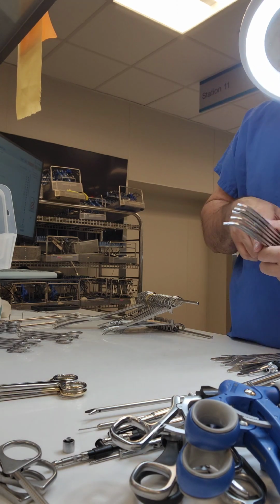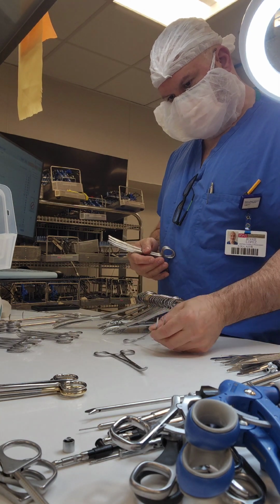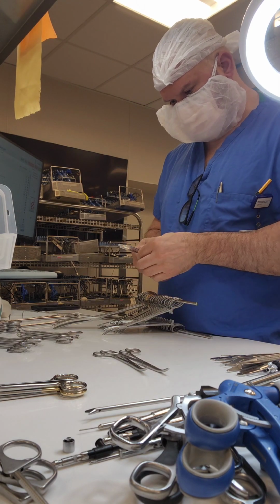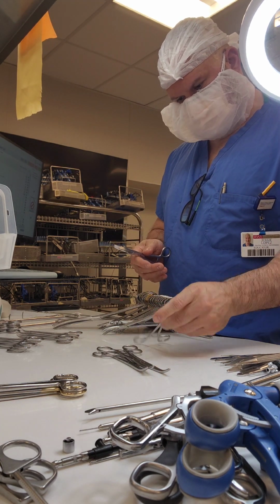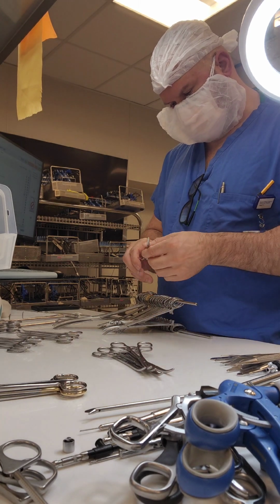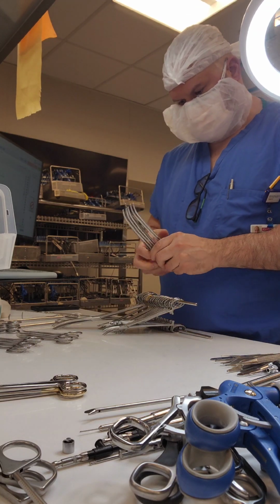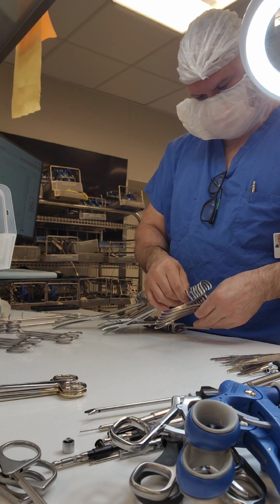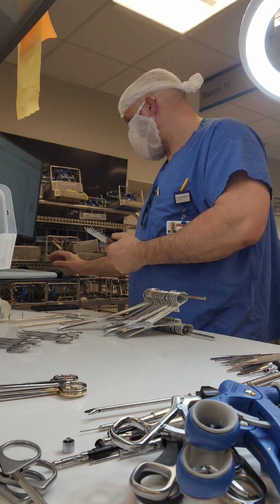Now, I will say I did have some wasted movements in this video. Okay, I probably could have shaved off like 15 minutes from my assembly time. But again, as I stated, I had other duties to do, but I wanted to show you all the little hiccups and all the little distractions that can happen while assembling as well. There were instances where my tap test failed and I had to get a replacement instrument. There were instances where I inspected my instrument and I knew it was damaged, so I had to go look for the instrument, and I knew where they were at, but sometimes where they're at is not always where they're at, right? It's probably in another location, so that took some time as well.